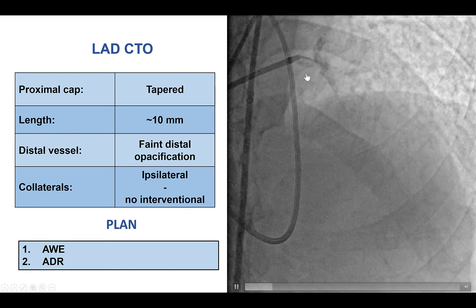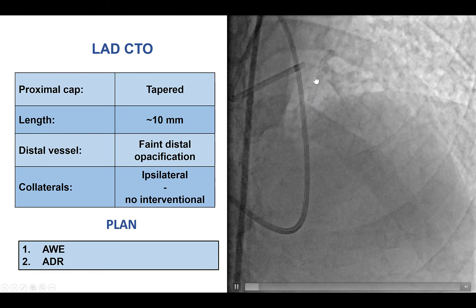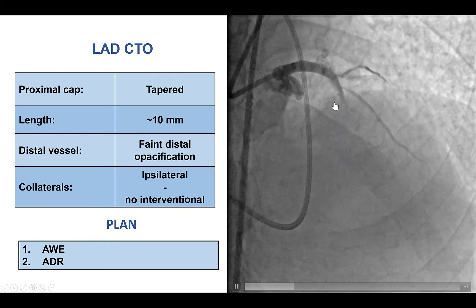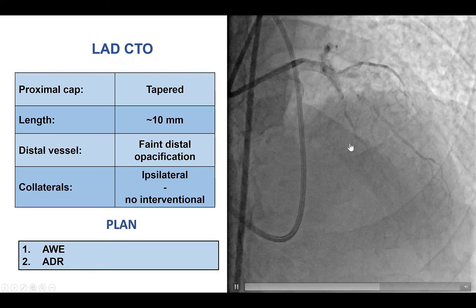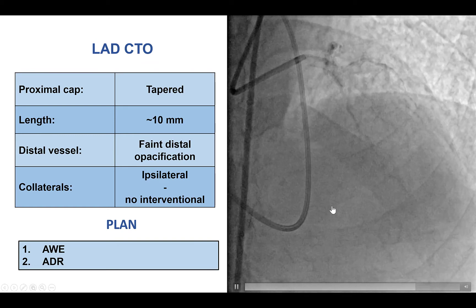Coronary angiography showed severe calcification, which is typical of a dialysis patient. The proximal cap was tapered and well-defined. The CTO length was approximately 10 mm, and the distal vessel was poorly visualized through bridging collaterals. There were no contralateral collaterals from the right coronary artery.